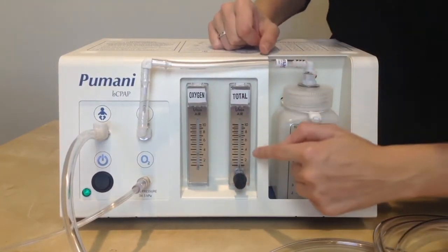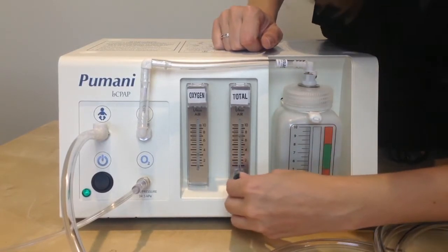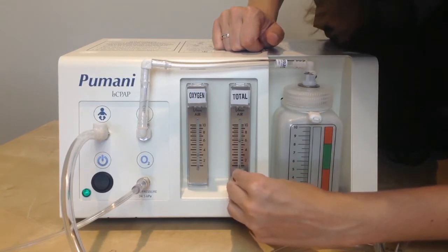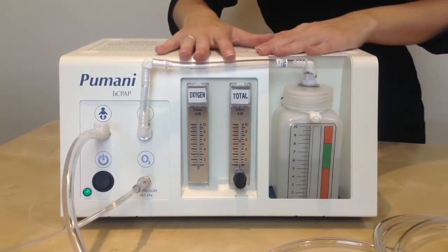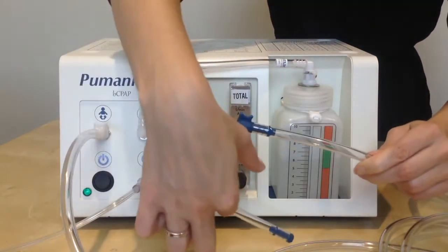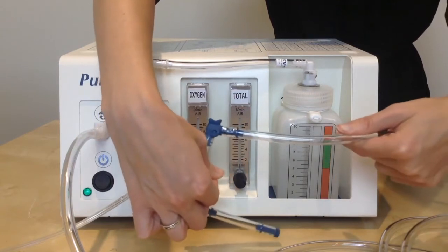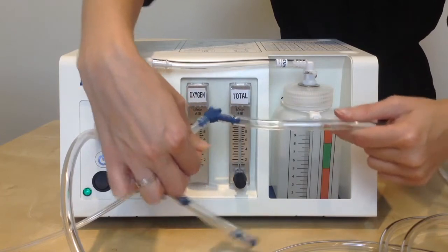Next, I will set the total flow. This should be 6 liters per minute. So you will need to increase or decrease until you're at 6 liters. Now that I've set both of the flows, I will take my patient tubing. On the end of the patient tubing are the prongs, and when you pinch the prongs, you should see bubbling in the water. And you know that your Pumani is now ready to go on the patient.